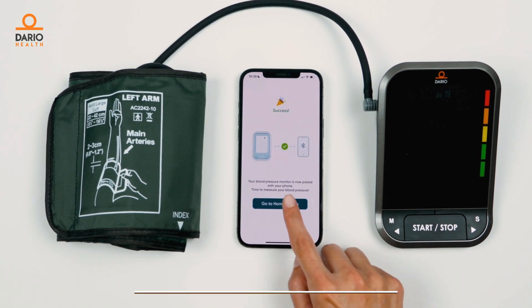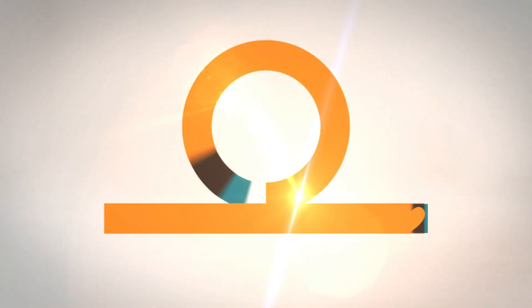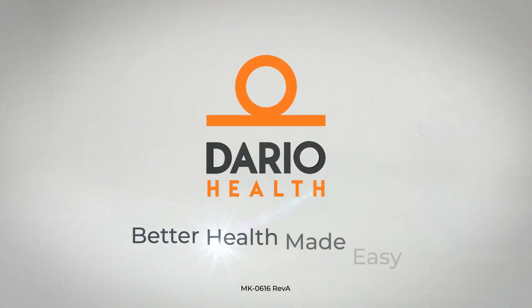All done! Now you're ready to take your first measurement. Dario — better health made easy.